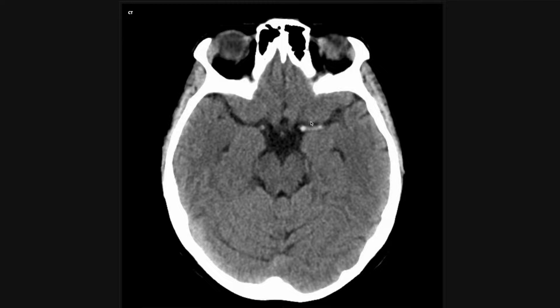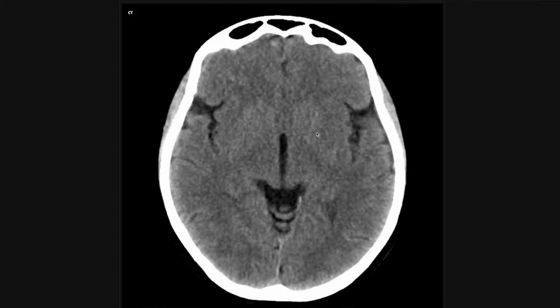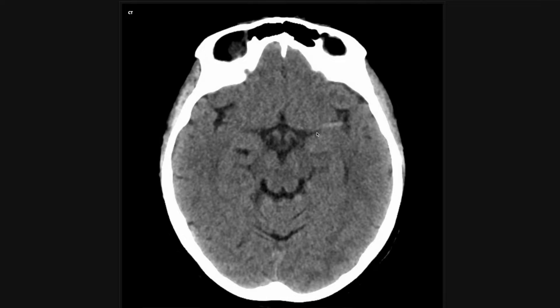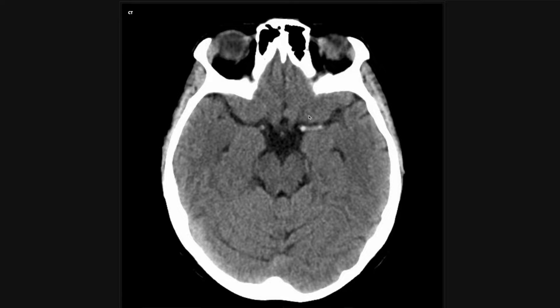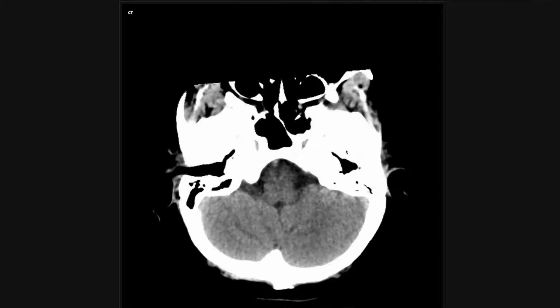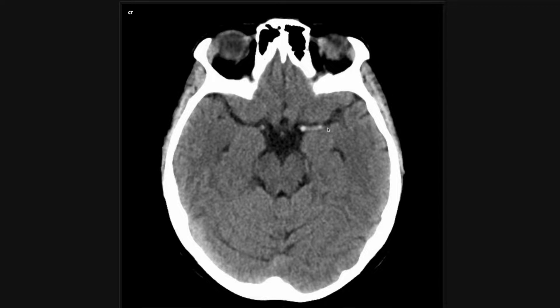This is the proximal aspect of the middle cerebral artery, something that potentially a neurointerventional radiologist can go retrieve. When you see this, there are a couple of things you should do. First, you should order a STAT CTA head and neck — an exam that targets the extracranial and intracranial arteries so you can identify the exact location of the thrombus. Keep in mind that sometimes vessels can appear dense without an actual acute occlusion, due to dense atherosclerotic disease that can fake you out. In this case, I feel confident this is real and this patient has an occluded MCA.